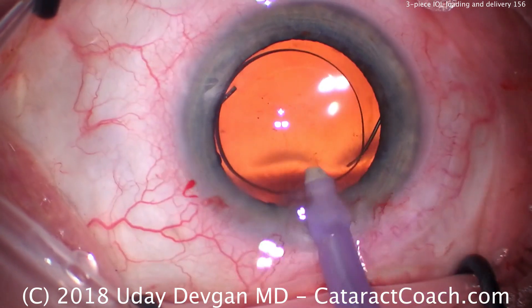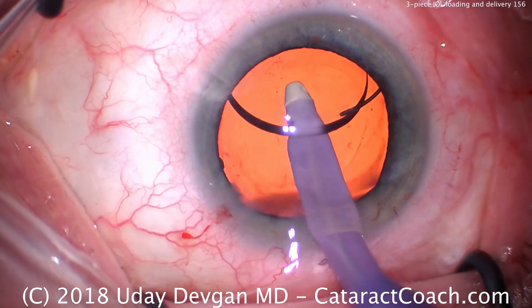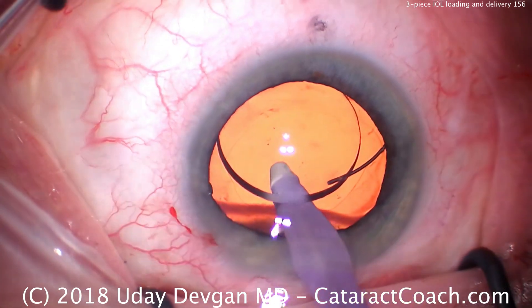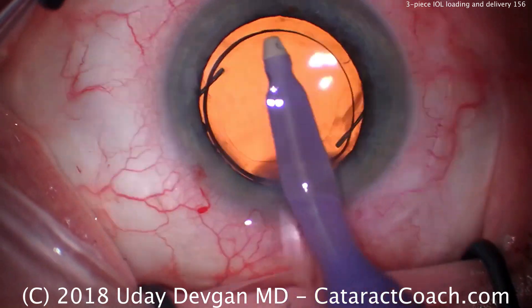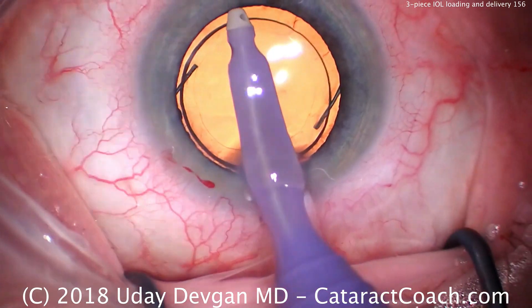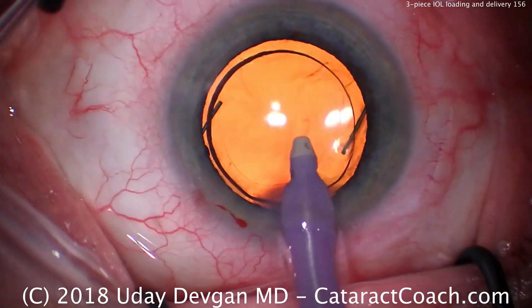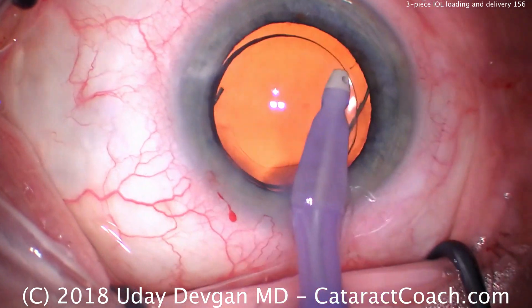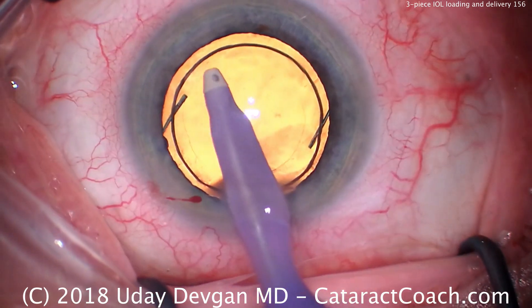Very, very important: if you're going to use a three-piece lens — and sometimes you're going to have to — you must make sure that when you inject it, it goes in the eye in the correct orientation. The key for these three-piece lenses is watching the leading haptic. If the haptic twists in the tip of the injector, you need to flip the injector inside the eye and deliver the leading haptic correctly. If it goes down straight, you're good to go. So keep these points in mind — thank you again for watching.